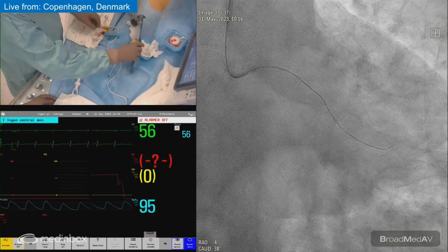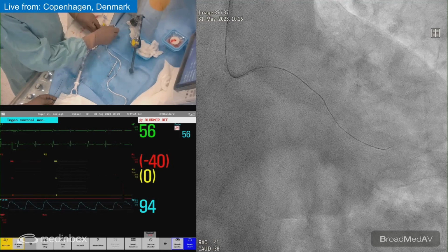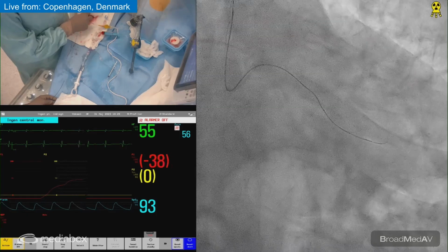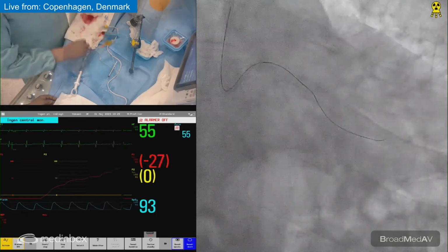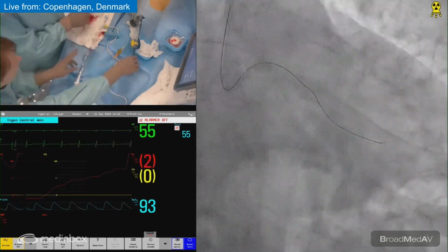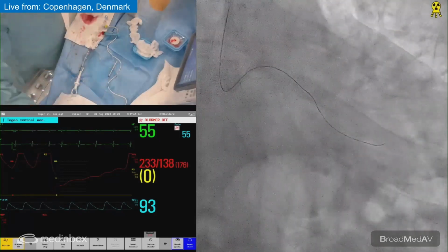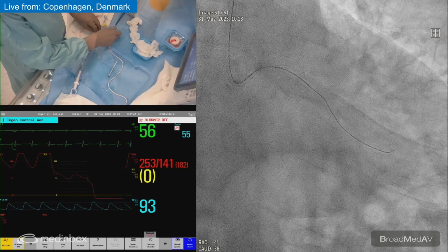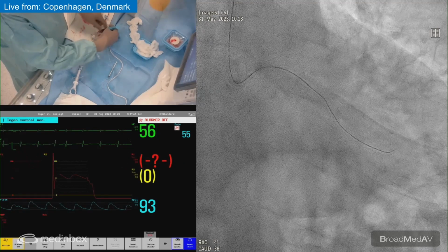In this case, where part of the double catheter is a monorail, then take the trapper out. We don't need the trapper at this point because part of the double catheter is a monorail, so you can bring that down without pushing the wire further into the vessel.